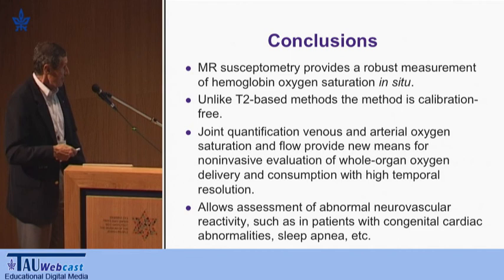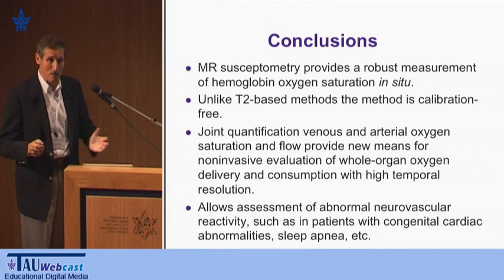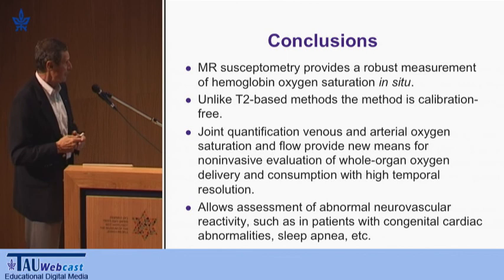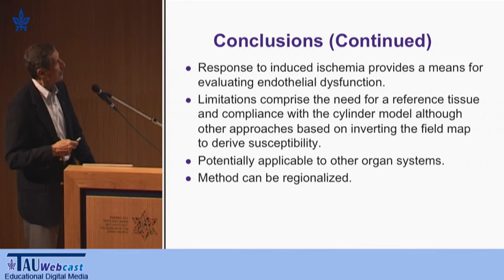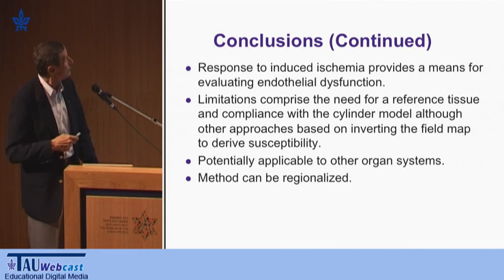So this allows assessment of abnormal neurovascular reactivity, such as in patients, I've mentioned that before, but decided not to show it, with congenital cardiac abnormalities. Sleep apnea is another one. The response to induced ischemia, I think I've shown that, as a means for evaluating endothelial dysfunction.